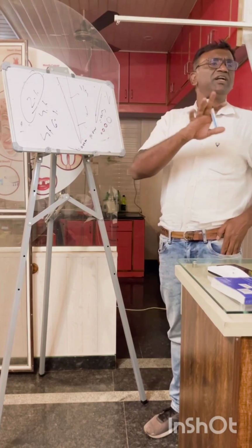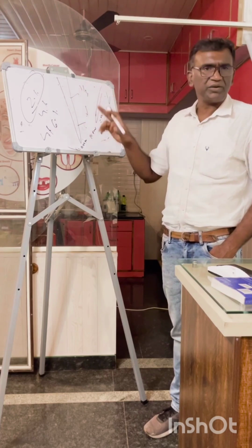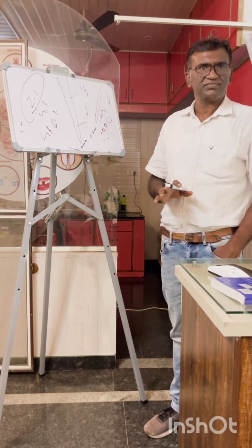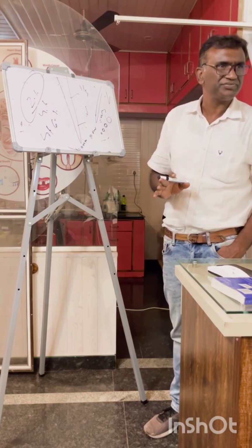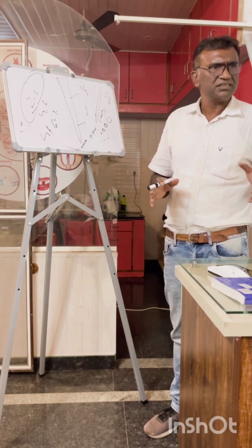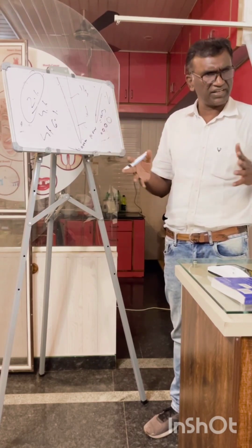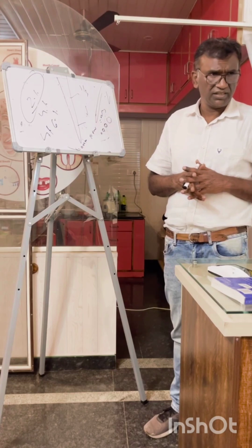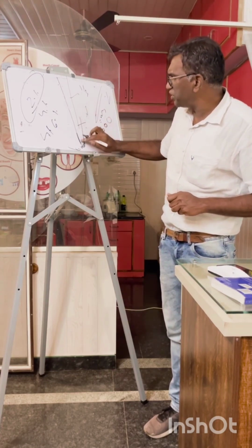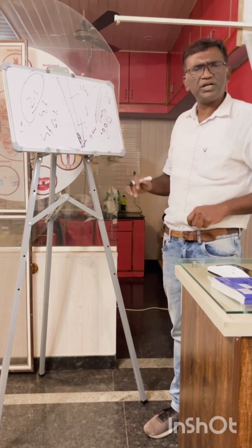If there is a non-vital tooth, a necrotic tooth, we have to increase our taper, irrespective of your anatomy. Why? You get a necrotic case, severe infection, draining abscesses, chronic reinfection. Then there are chances of biofilm at the apical third. Then you have to increase your taper.